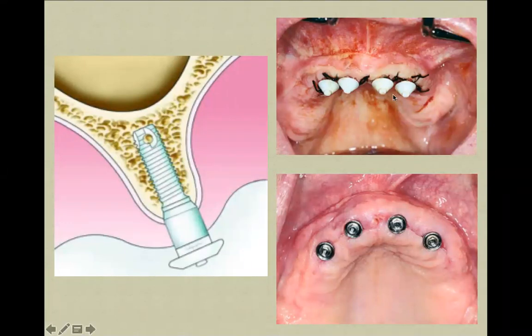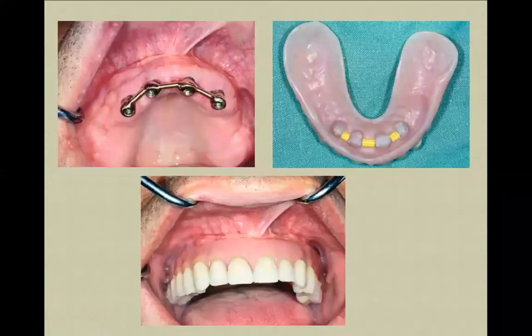And you're placing a few sutures. Well, yes, for the healing cups, I'm usually placing a few simple interrupted sutures like this. And here is the situation after the placing of the healing cups, and the mucosa seems to be good. Here we still have, as you can see, a line here, some adhesion here, some line here. That's still a kind of regeneration process, but it's not a problem. You can start your prosthodontic rehabilitation.